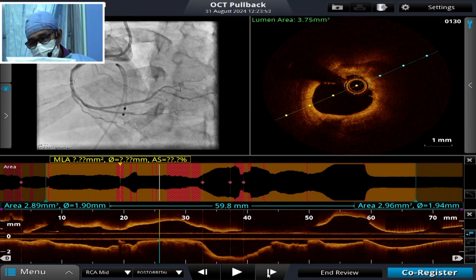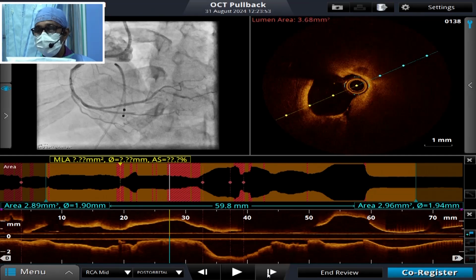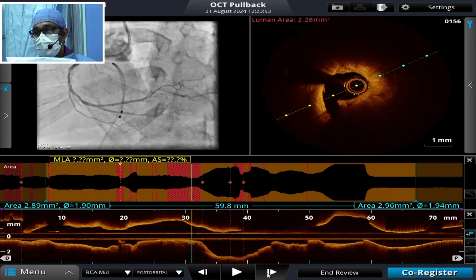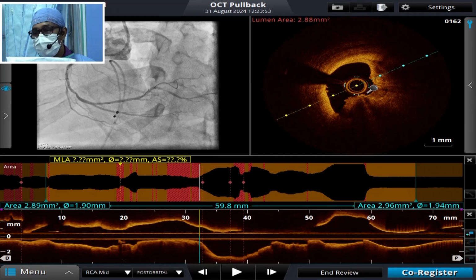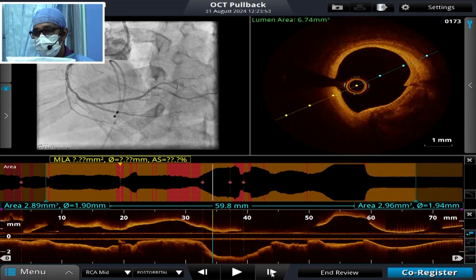That actually happens at the area where the imaging catheter is very close to that particular calcified area. That is where the sanding has happened. As we come more proximally, that is a gutter, a very classical gutter. Yes, that is a gutter, exactly, created by the sanding.